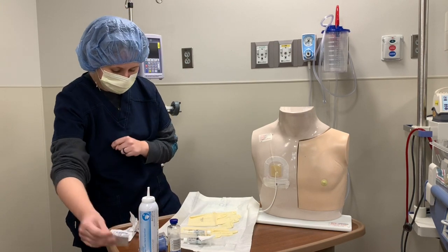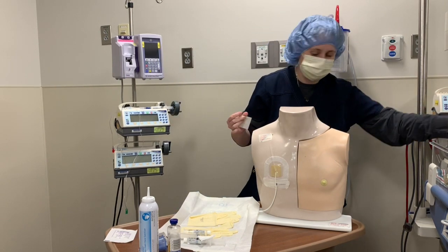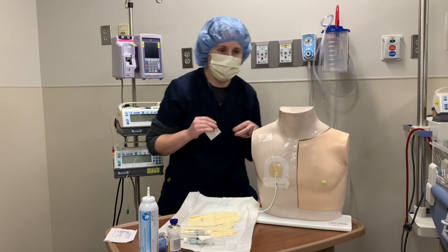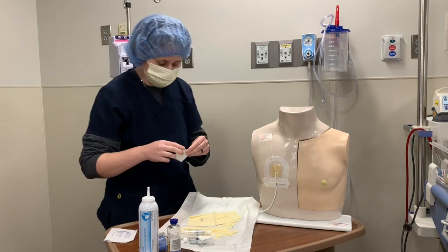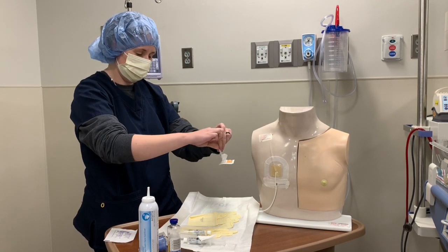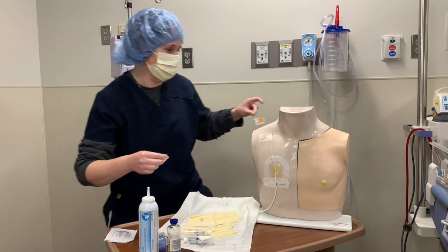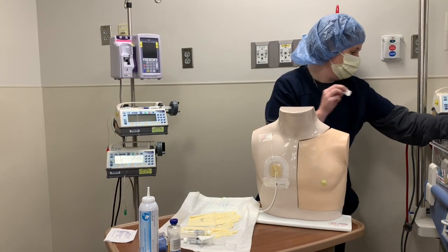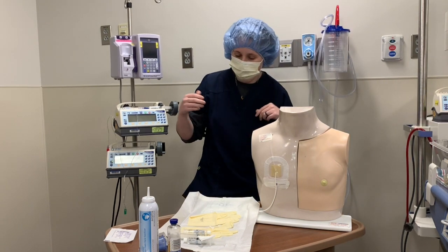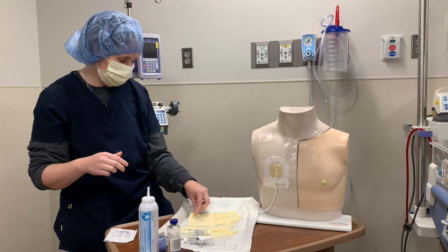For your alcohol and 2x2 gauze packages, the contents can hang out in the package even when you rip them open, so you sometimes have to rip in a couple different directions and then it'll drop out without contaminating. Then, without touching any of the supplies, I'm going to put on my sterile gloves — but first, I'll wash my hands.